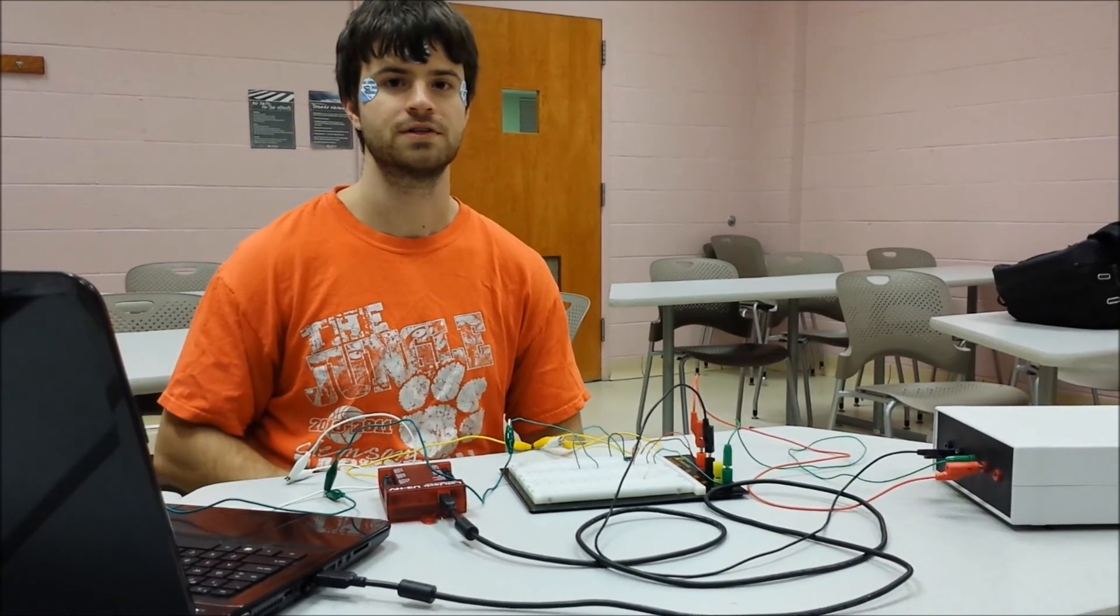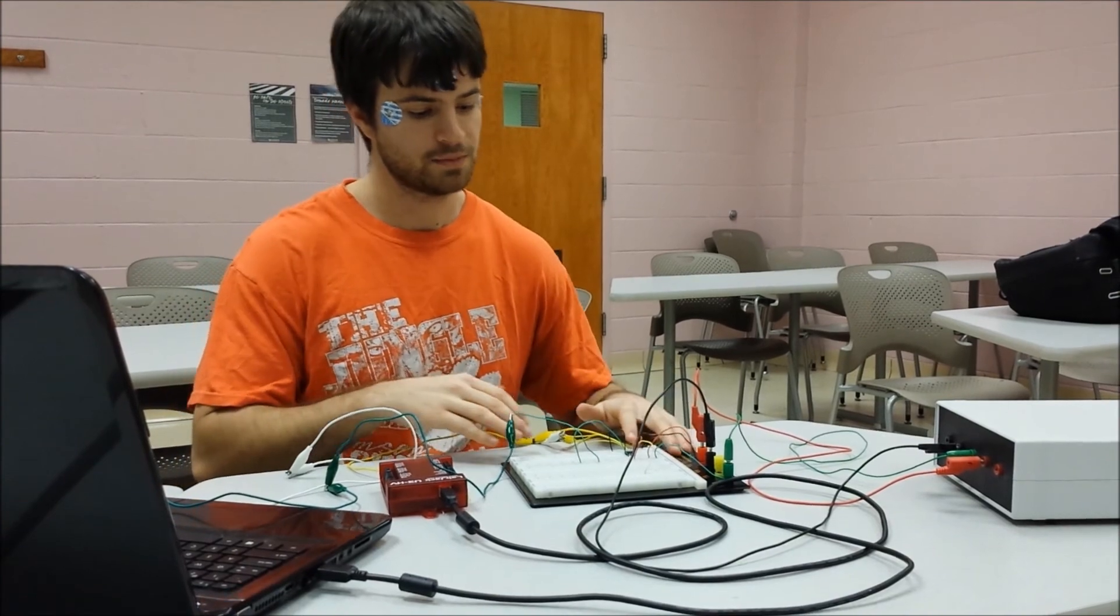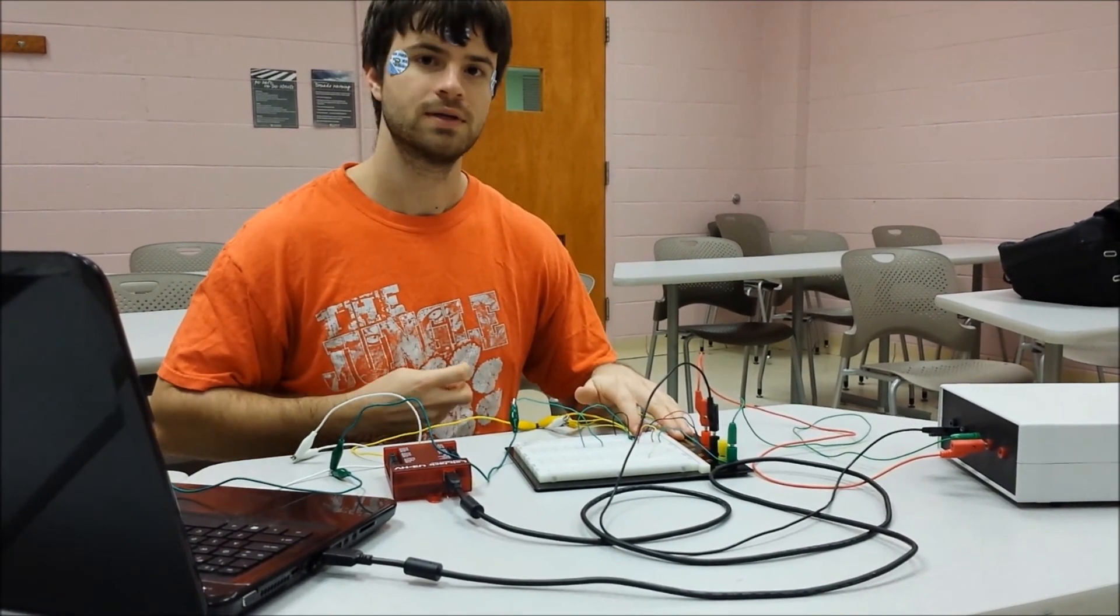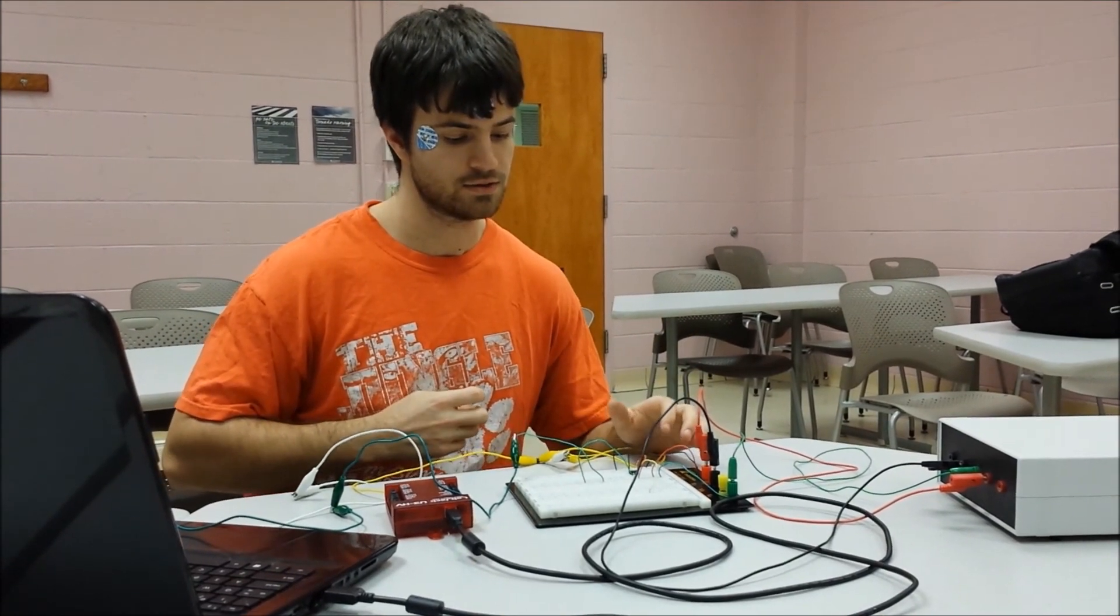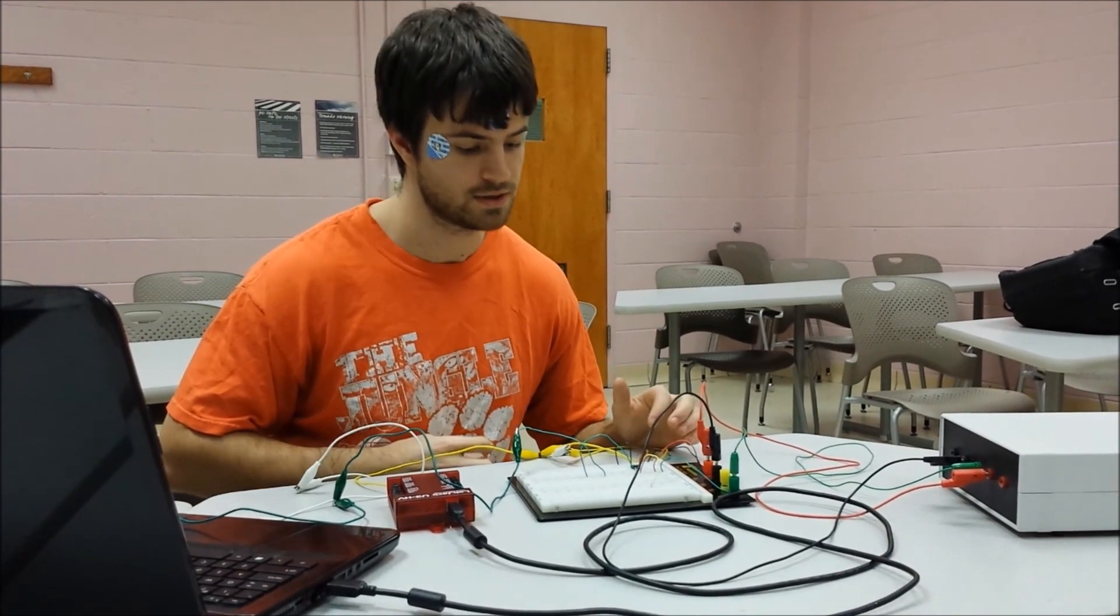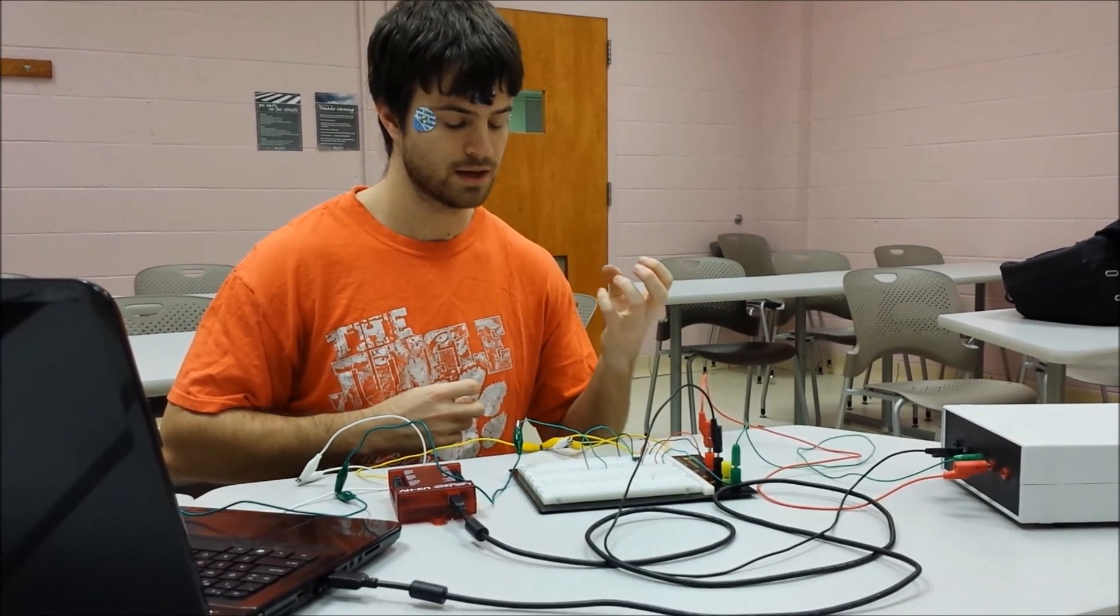Alright, so what we have here is our physical setup. What we have on the breadboard here is an INA126P, which is an instrumentation amplifier. The gain is set to approximately six, using an 82K resistor across the gain.